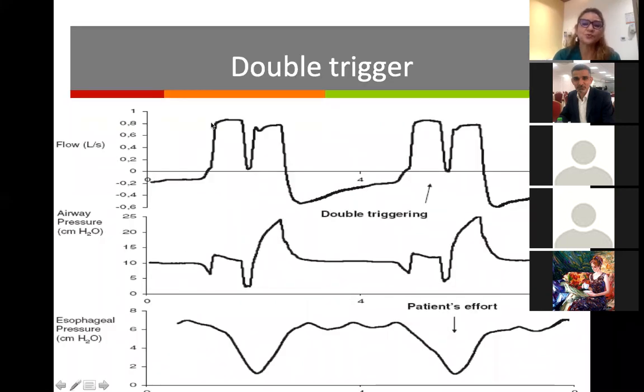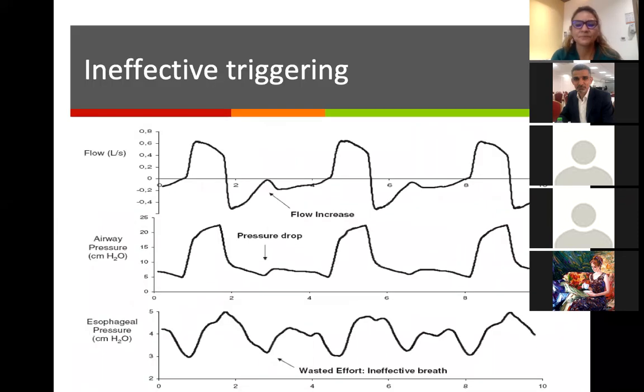And then sometimes you may have double triggering. This will happen when your baby is too strong. Dr. Monica, or good sedation. Yeah, right? On the previous slide? Yeah, or a good sedation, if you don't want to change the trigger. Yeah, that can be done here.